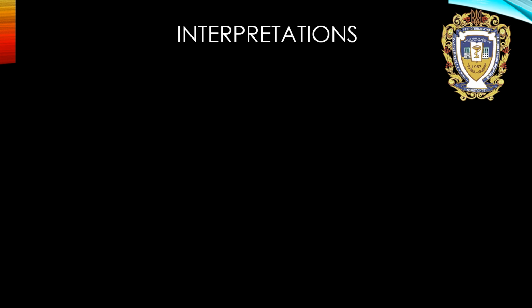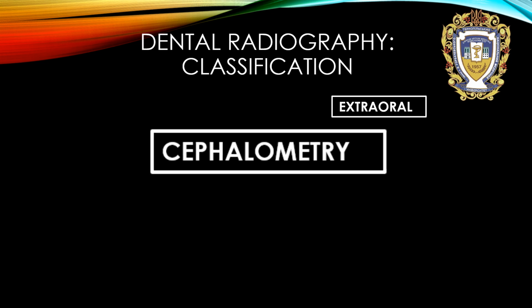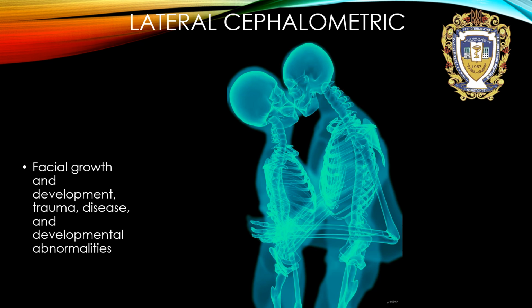It was a short summary of previously covered information. Extraoral cephalometry. What information can we get from evaluation of cephalometric X-rays? Facial growth and development, trauma, disease and developmental abnormalities.